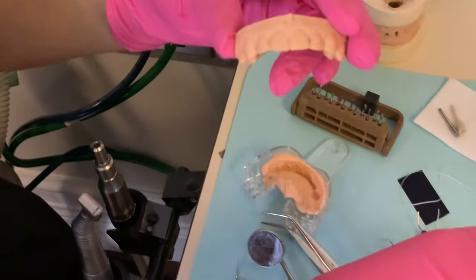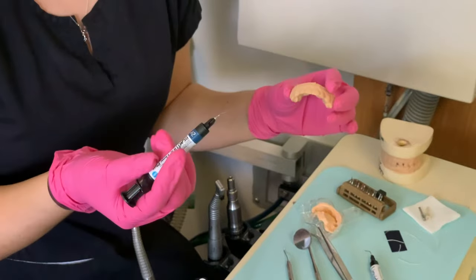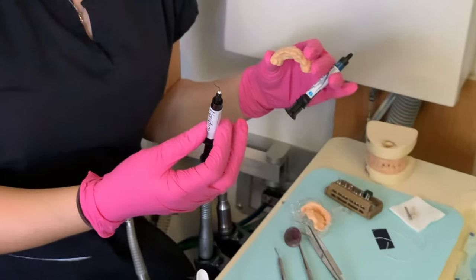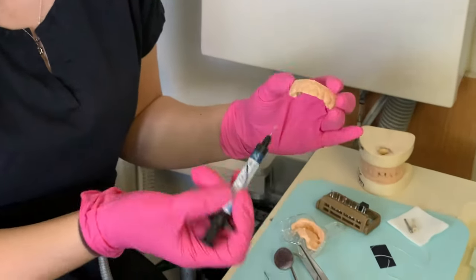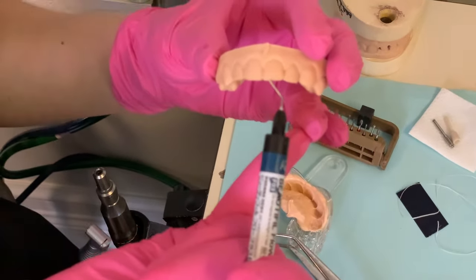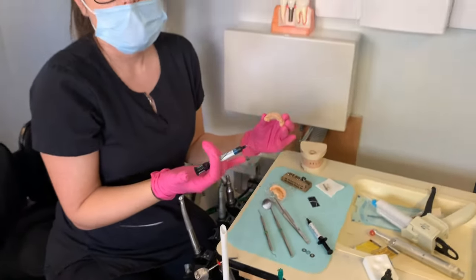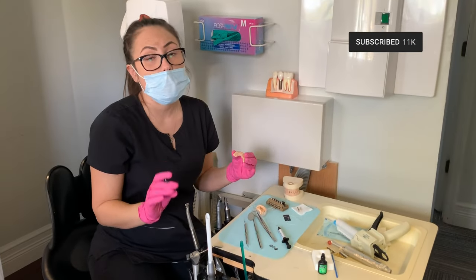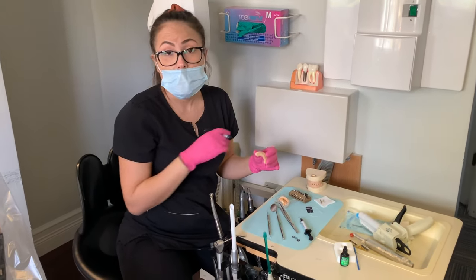What I suggest is you can keep some expired flowable to do this, or if you don't have any and you don't want to use up your composite, you can save up the liquid dam from whenever you do zoom whitening and it will help you as well. For example, let's say this tooth was chipped on the incisal — you would go ahead and add flow wherever it's chipped to make the tooth look pretty and cure it. Then you take your impression like that, because it's going to save you a lot of time later on when you're shaping your temporary. It's a really nice trick that is going to save you so much time.